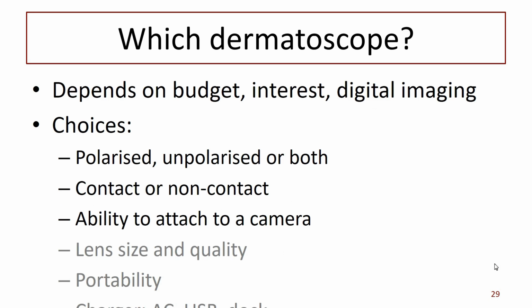Which dermatoscope should you get? Well, of course, it depends on your budget. Now, we do have one for sale at this conference for $26. Now, that's only 3 or 4 cups of coffee. I think we all should be able to manage it. No, it's not the best dermatoscope. But in my opinion, the best dermatoscope does not require $2,000, which you could pay, or more.